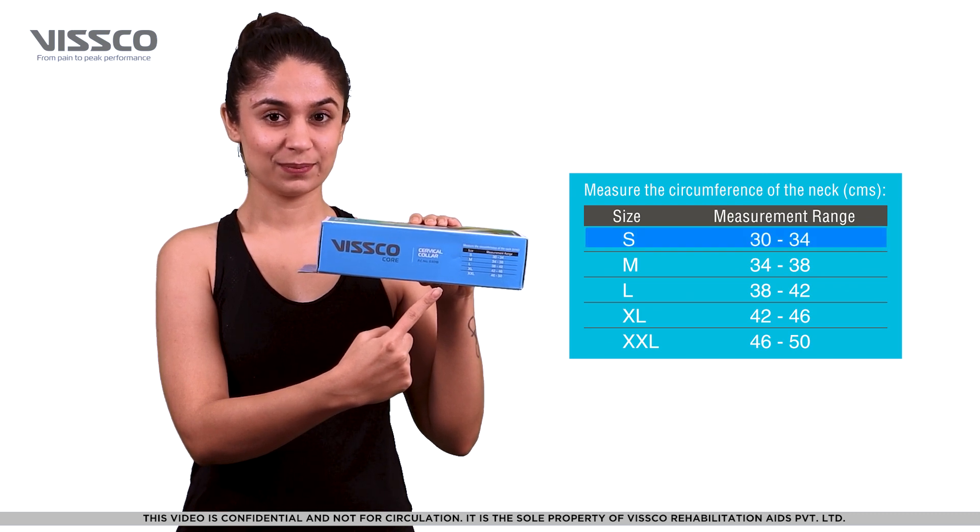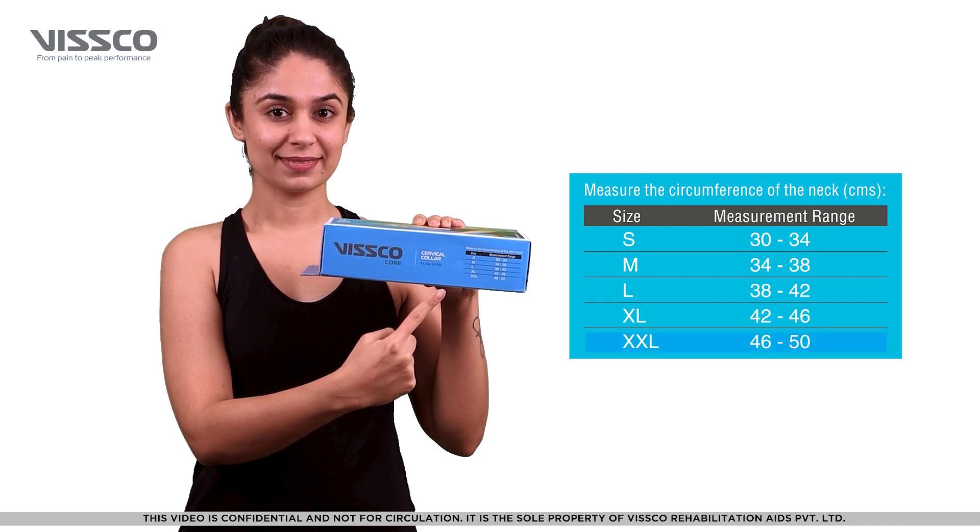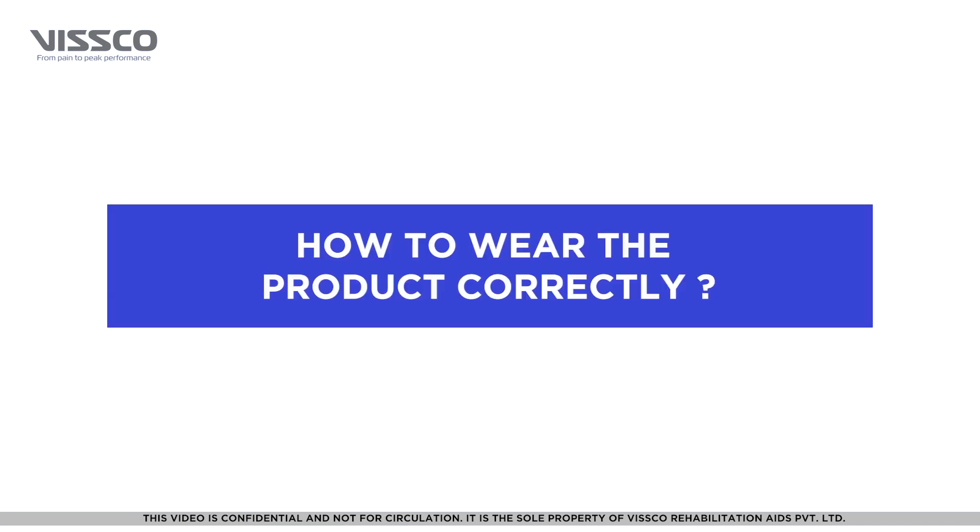You can choose from small, medium, large, extra large, and extra extra large. Now that you have selected the right size, let's wear the product.